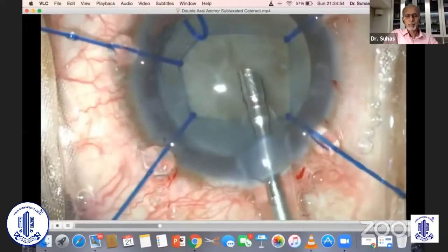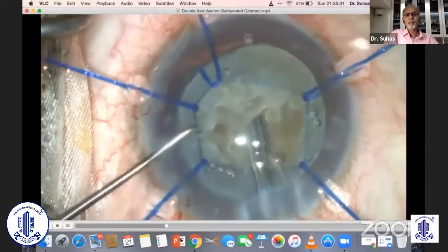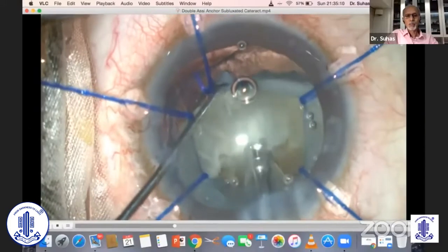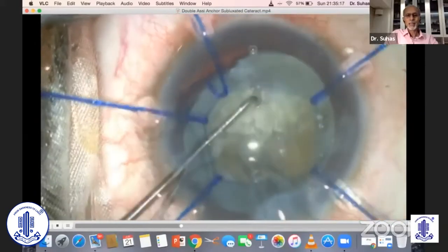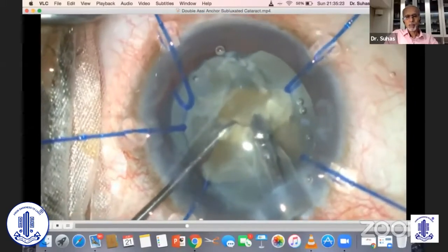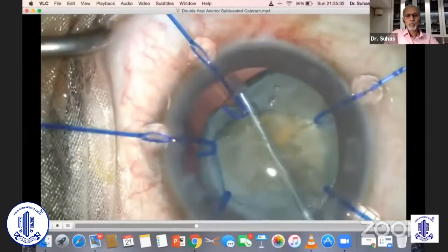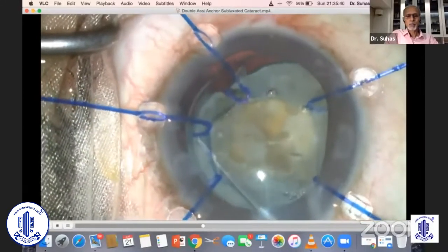The next obstacle is that the nucleus is extremely hard. You have to separate your endonucleus from the epinucleus wherever possible, and try to get the nuclear fragments out of the bag to engage and emulsify them. You also have to keep injecting viscoelastic into the bag to protect the posterior capsule — inflate the bag — and this process you may have to do more than once.